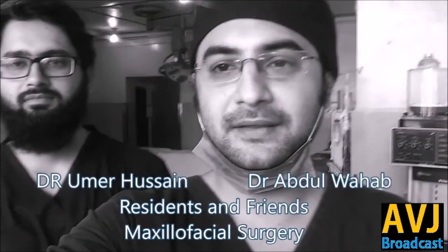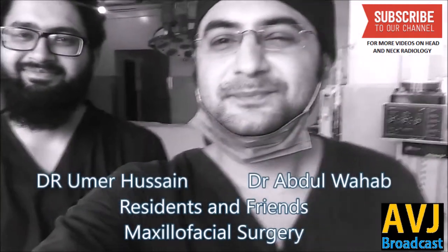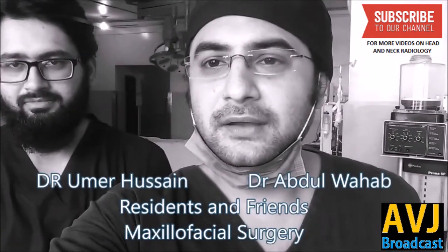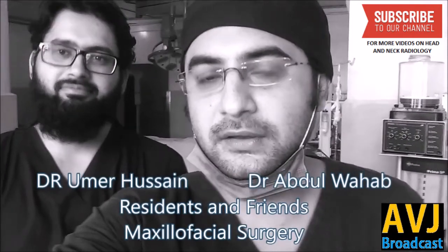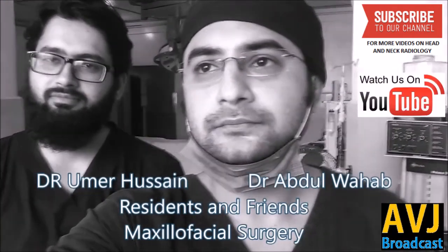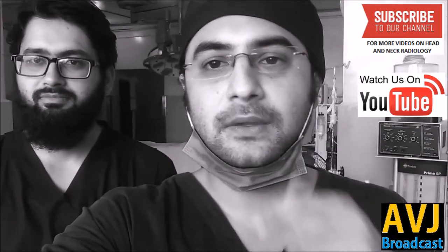Hello everyone, I am Dr. Abdul Wahab and he is my associate surgeon Dr. Umar. Today we are going to demonstrate an auriculotemporal nerve block along with an intra-articular injection in the TMJ. First we will do the marking and then we will demonstrate the injection as well. So let's start and see how it goes.